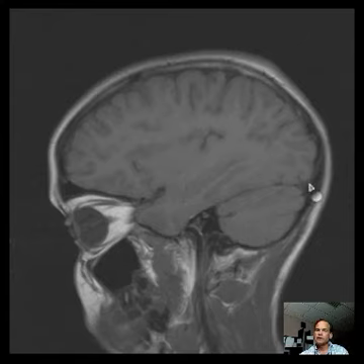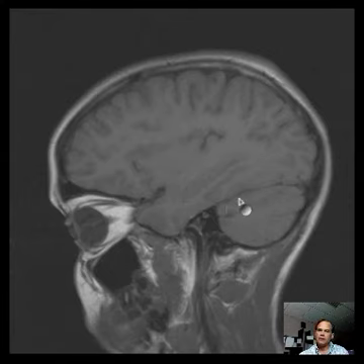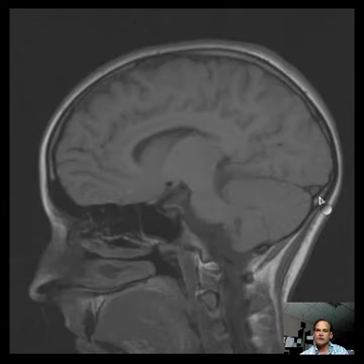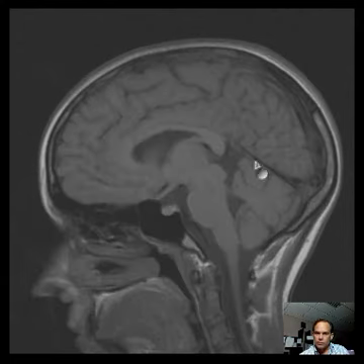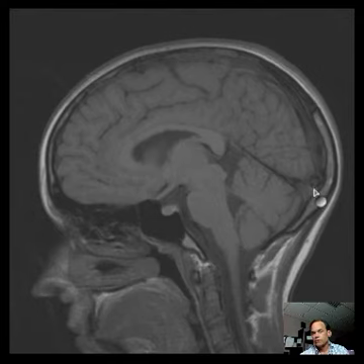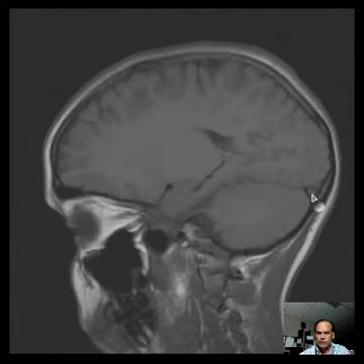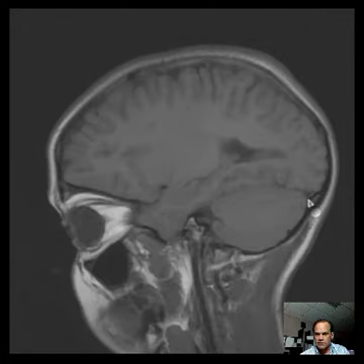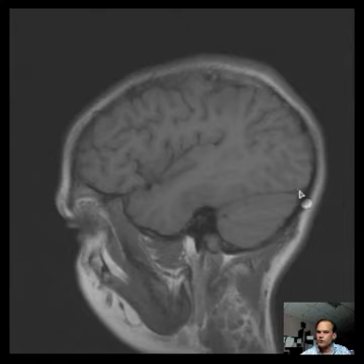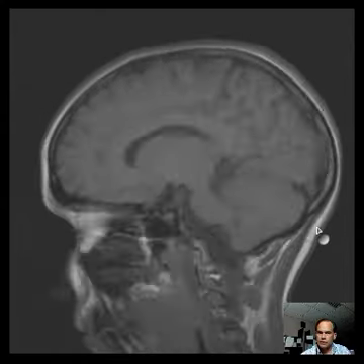That separation is just a little black line — the tentorium, a sheet of dura. Notice how the tentorium blends imperceptibly with the margins of this venous sinus — the transverse sinus. Going to the midline, there's a straight sinus that comes back, and a superior sagittal sinus that converges in this area called the torcula. From the torcula, the transverse sinuses go off to each side, tucked in at the posterior margin of the tentorium.